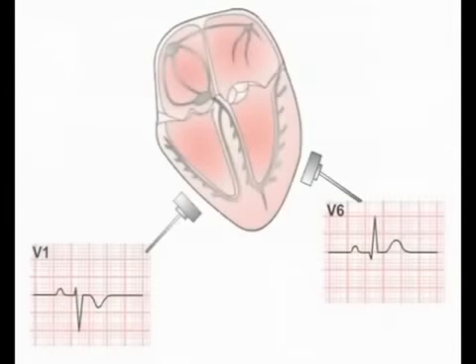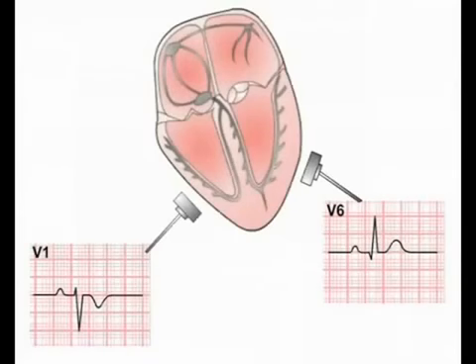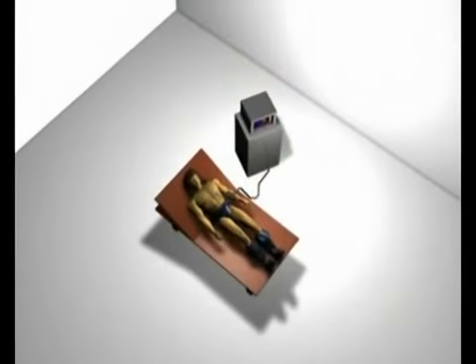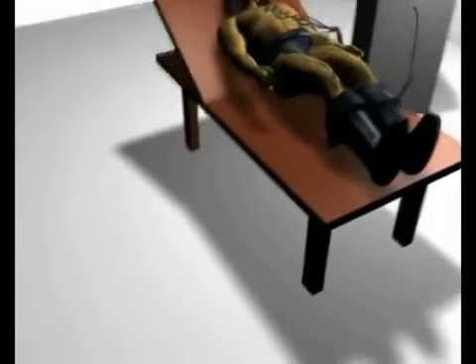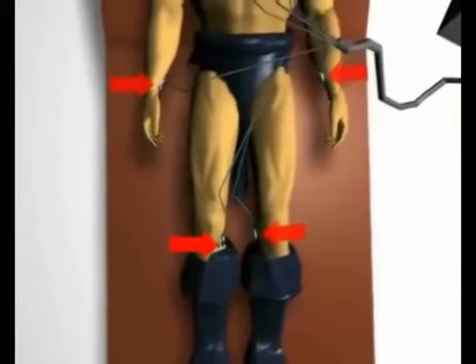We've seen how the cardiac depolarization and repolarization waves spread through the heart. Now we will go on to explain how these electrical events are analysed by the ECG leads to produce the waveforms of the ECG readout. Again, we will work with the 2D schematic of the heart as explained in video 1 of this section. The leads of the ECG machine detect the movement of the cardiac depolarization and repolarization waves as they spread through the atria and ventricles.